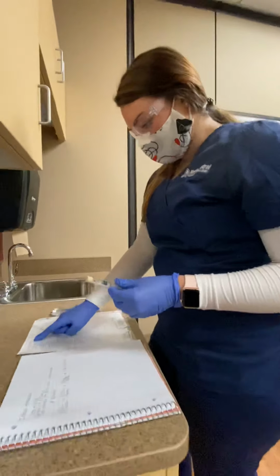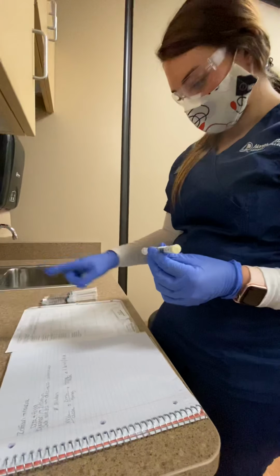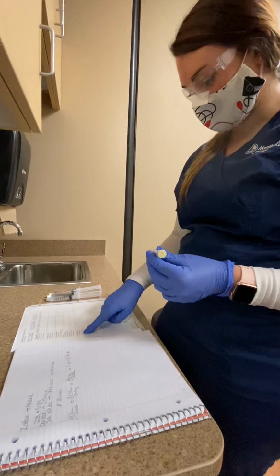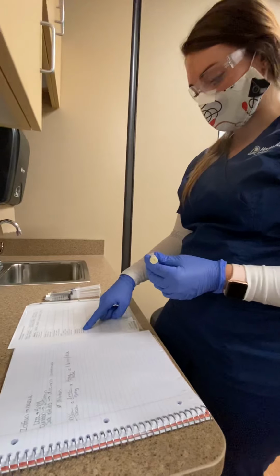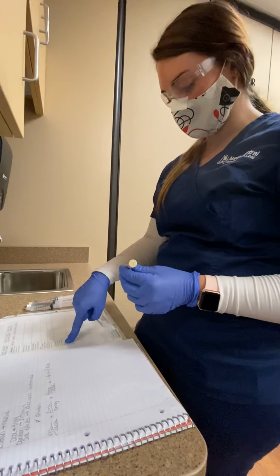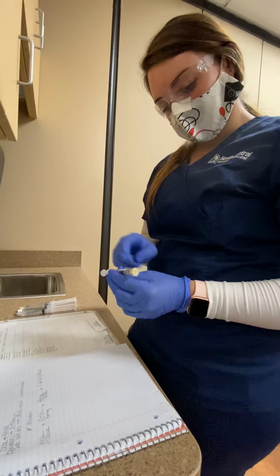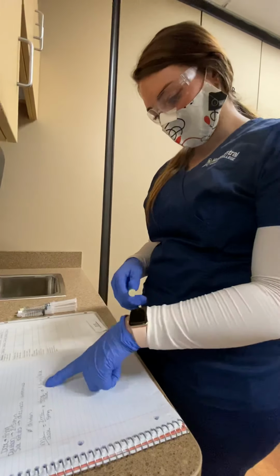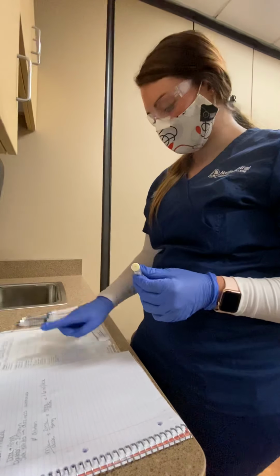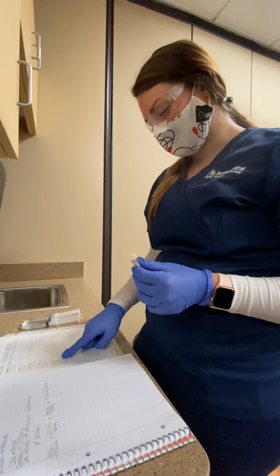So I have Mary Smith. Her allergies are morphine, and this is Zofran. The order is 4 milligrams IV push every 4 hours, PRN for nausea, and she hasn't had it for 6 hours, so we're in the time frame. Zofran, after my calculations, I need 1.6, got 1.6. Mary Smith, allergies are morphine. Zofran, 4 milligrams IV push every 4 hours, PRN.